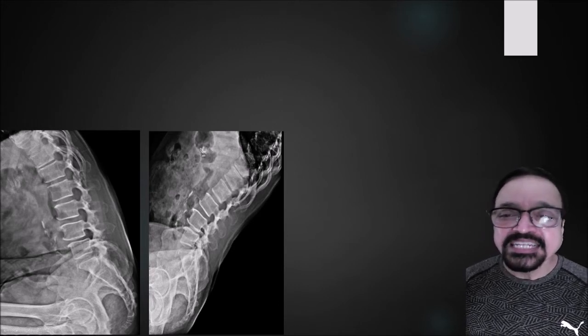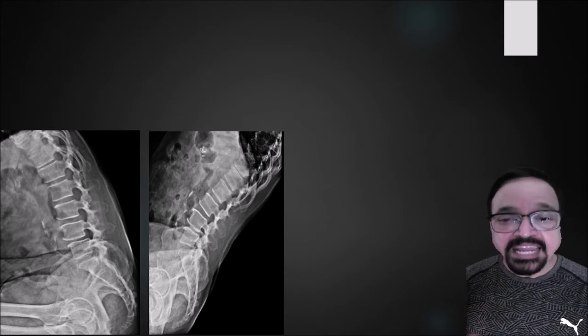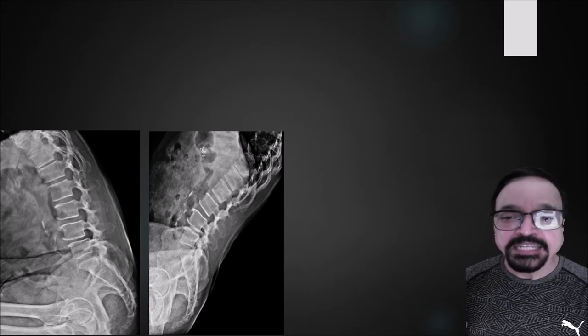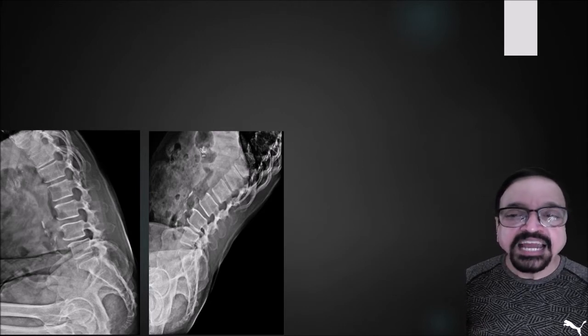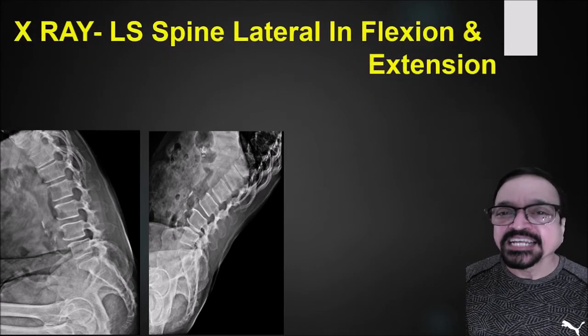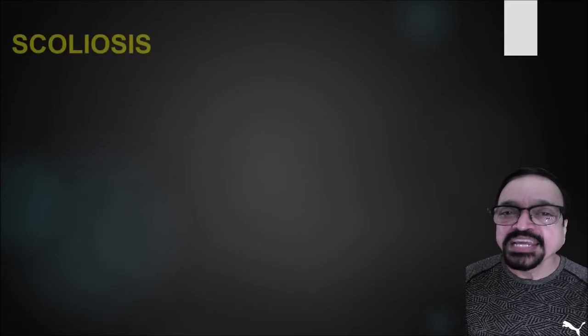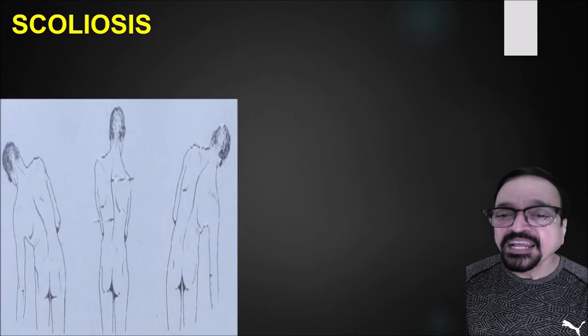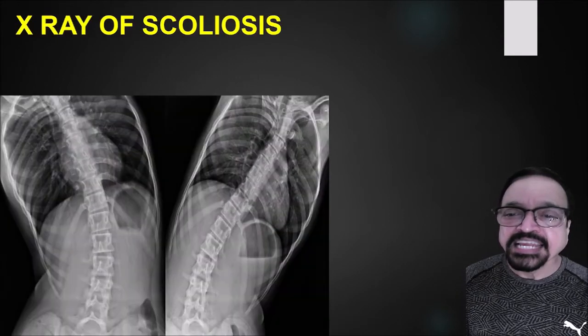So these three things you will have to see. One thing is the vertebral body position, whether they are moving or not. Number 2, intervertebral disc spaces. You can easily observe the L4-5 vertebral disc as well as other vertebral disc spaces, and you can clearly get what is the advantage of flexion and extension X-rays, and that will give you a perfect diagnosis of the affected disc as well as instability, which surgeons need for the operative workup for fixing and otherwise.